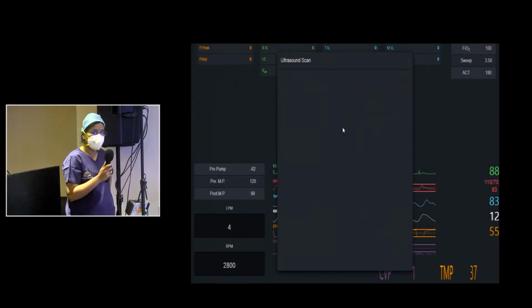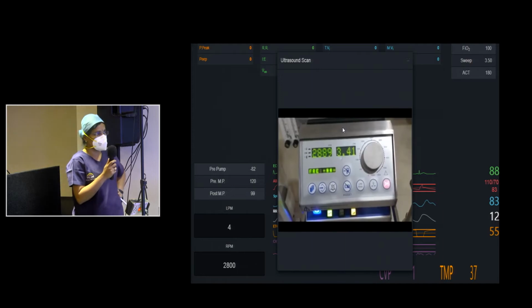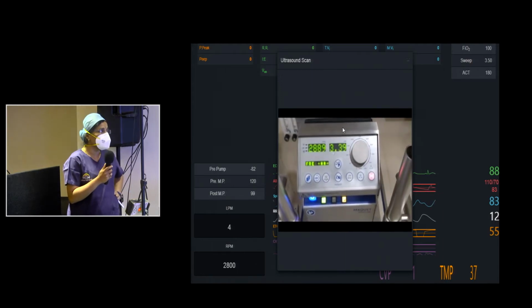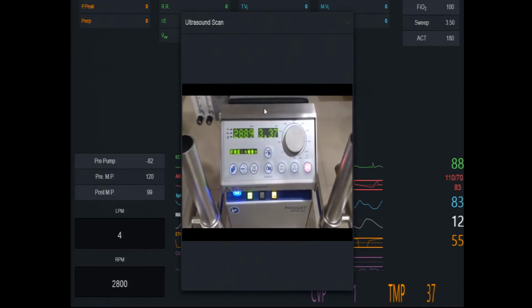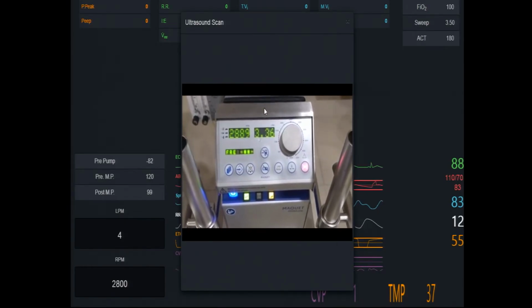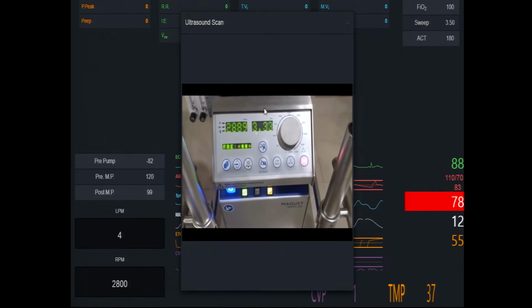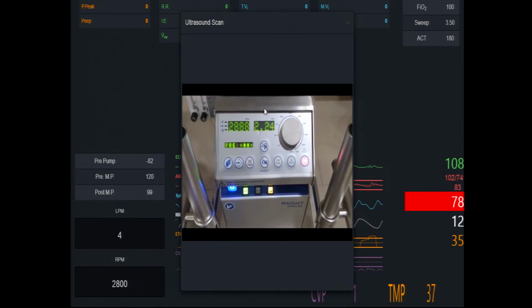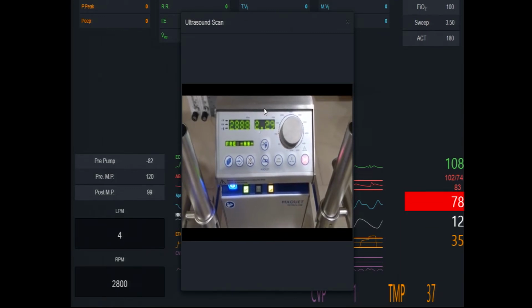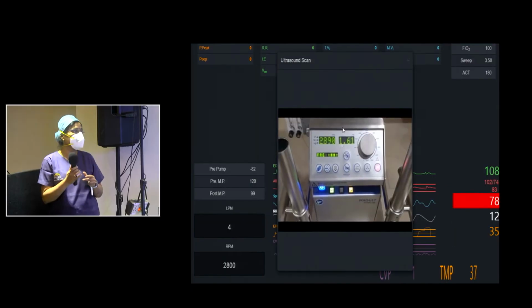So the next scenario would be, again, the patient is okay on ECMO. Suddenly there is a desaturation and there is flow fluctuations. You are starting with a comfortable 2500 RPM, 2800 RPM. You are able to achieve 4 liters flow, and suddenly you see there is a flow fluctuation. So what do you think is the most common cause here, and how are we going to manage?